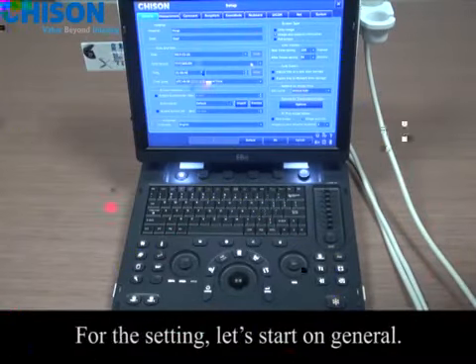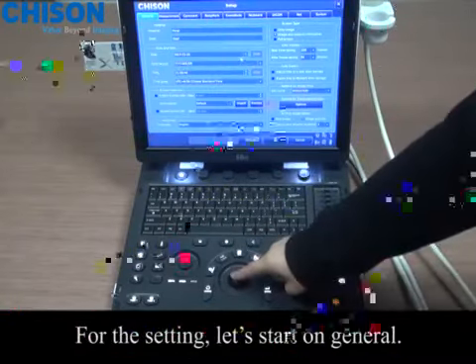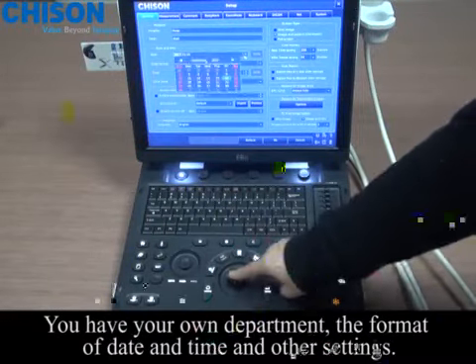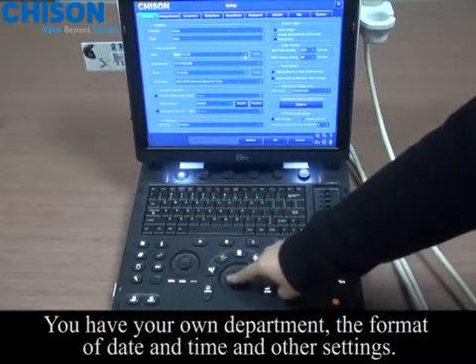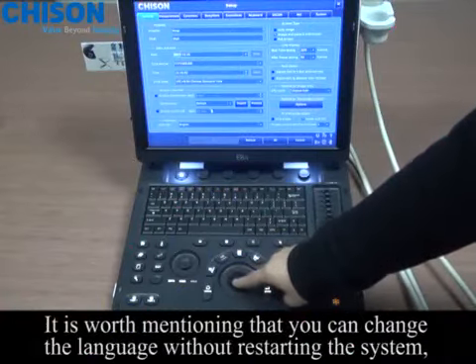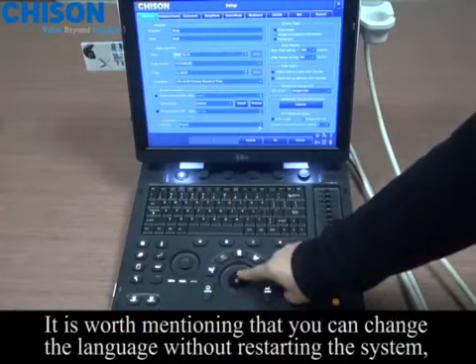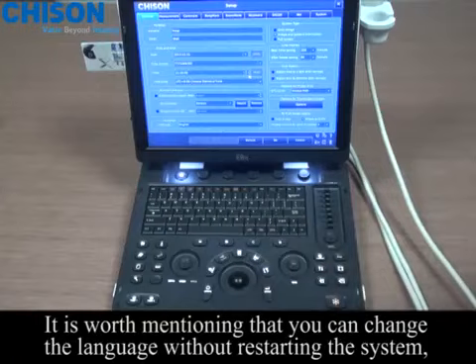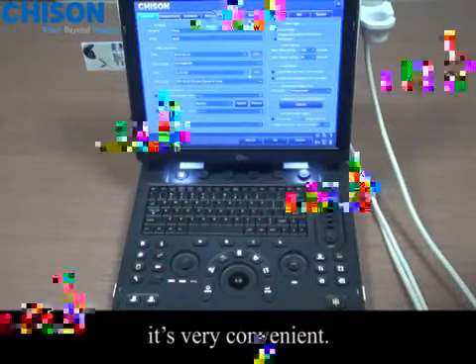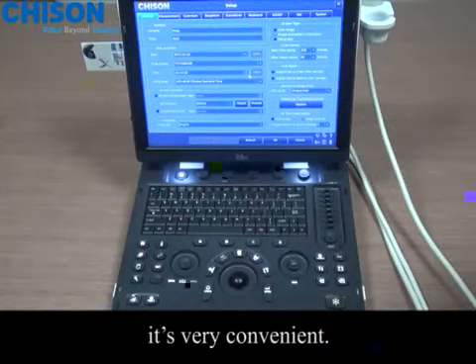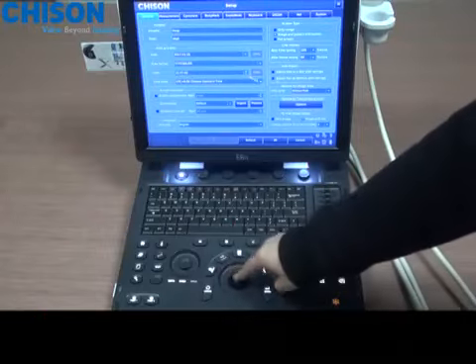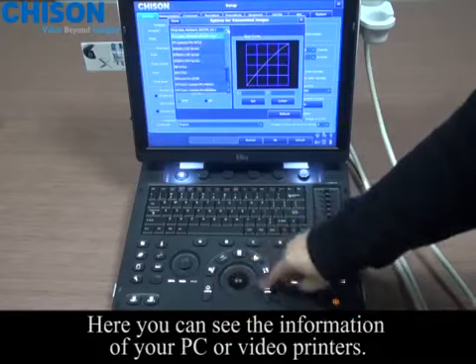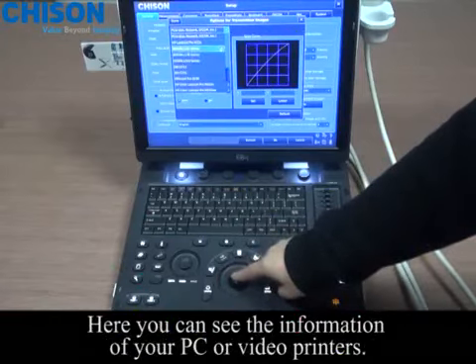Press the system setting key for settings. Let's start on General — you have your own department, the format of date and time, and other settings. It is worth mentioning that you can change the language without restarting the system, which is very convenient. Here you can see the information of your PC or video printers.